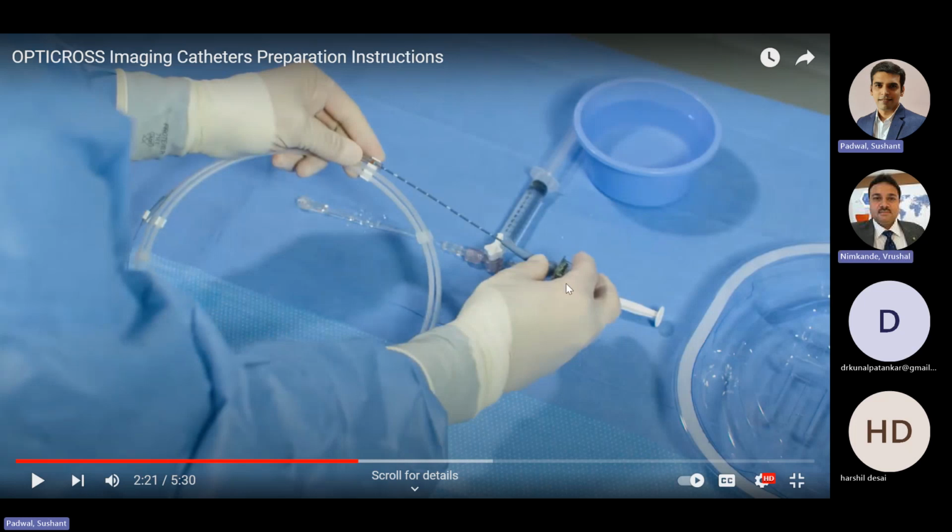While pulling it back, you will keep watching under fluoro the movement of your transducer on the screen. The moment your transducer comes at the proximal healthy landing zone, and that same image is matching with the IVUS image, that this is a good healthy landing zone, you can stop your pullback there. Simply count the number of dots. This will give you the exact length.